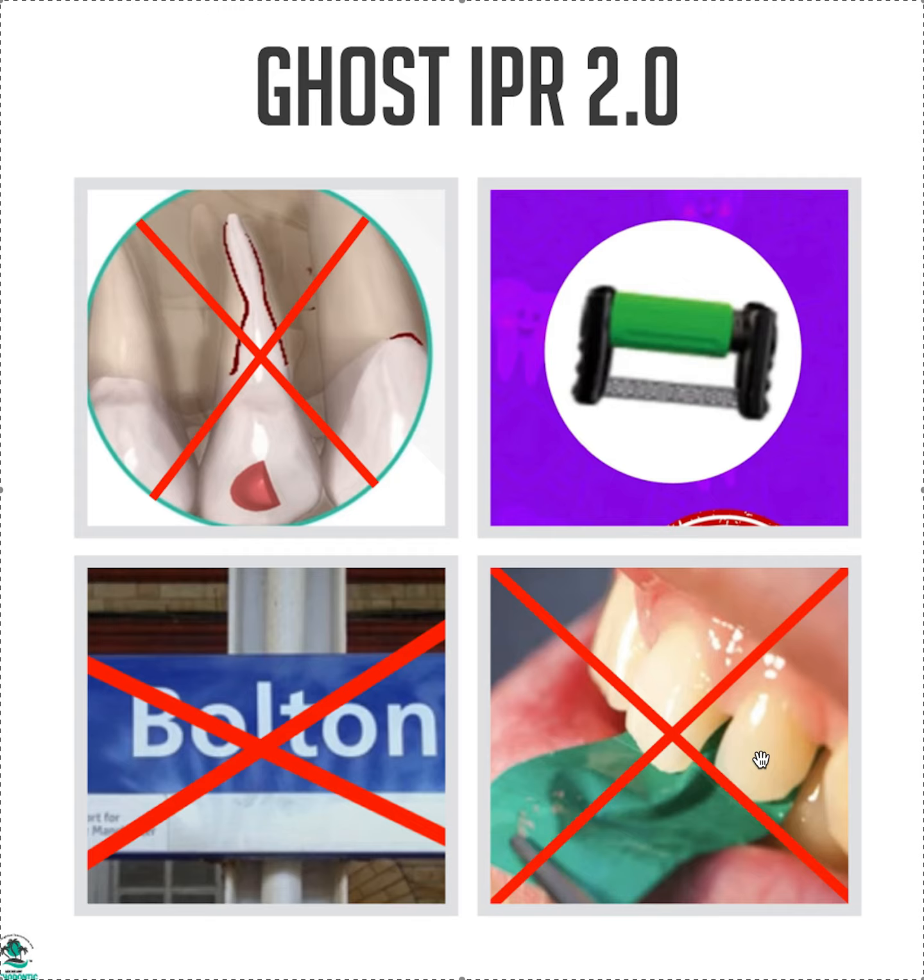So what else? If you have a case and hopefully you're using some type of CBCT function and you're taking a CBCT, if you've got it, you should really use it. It's absolutely miraculous, especially on adults. Otherwise, you've got to go old school and take cephs, take CBCT sagittal slices. You've got to palpate the bone. Look for washboarding, because sometimes you can't, quote, expand away the crowding or expand away the IPR because you're going to have fenestrations. Here's an example right here.